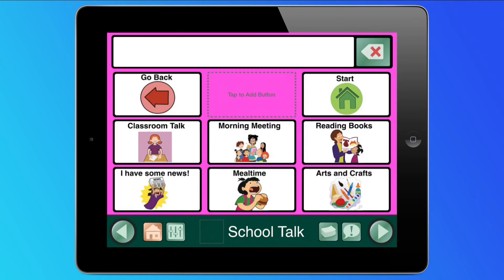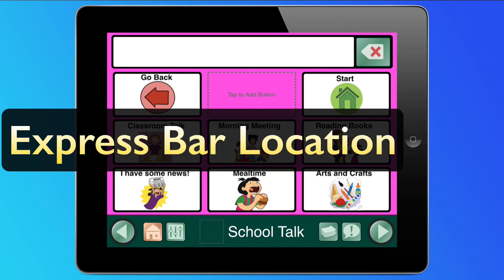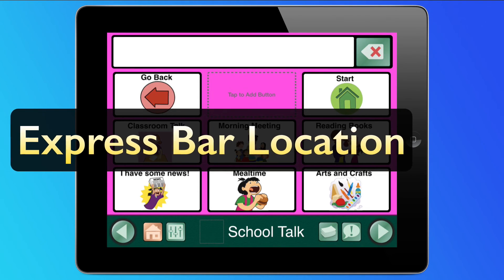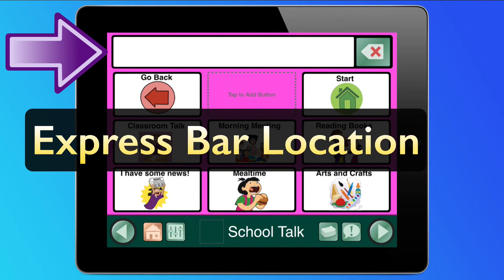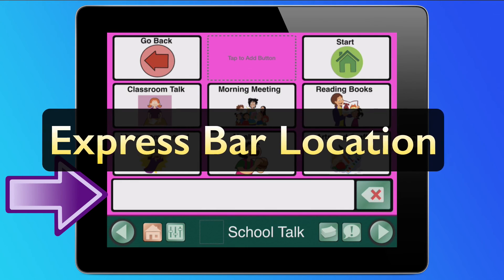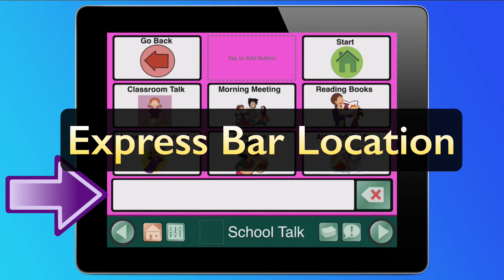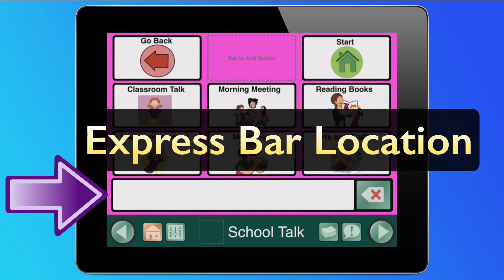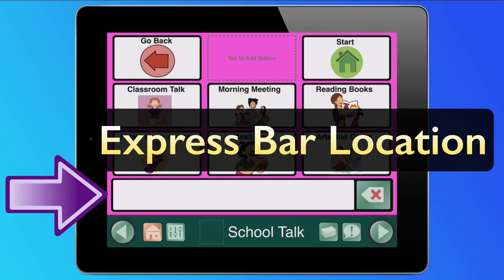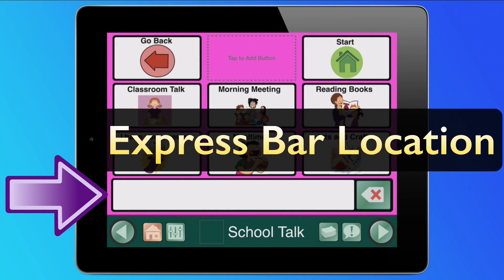And finally, the express bar can now be placed on the top or bottom of the screen, and you have the choice of whether or not you want it accessible during scanning.